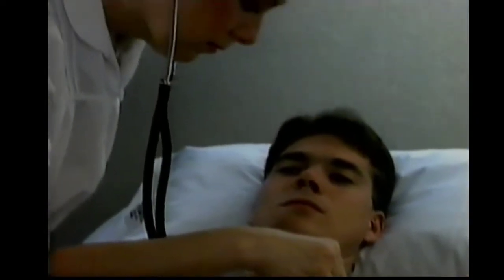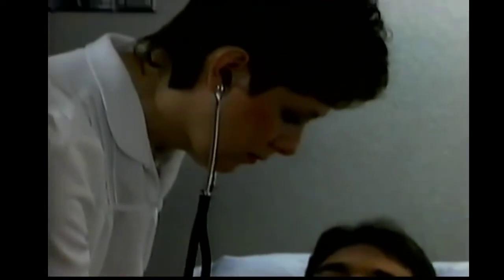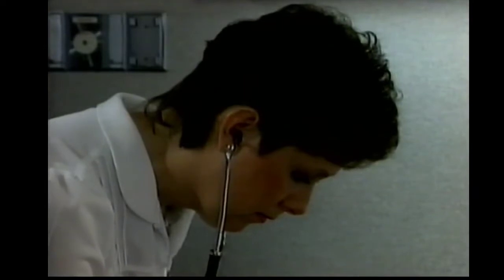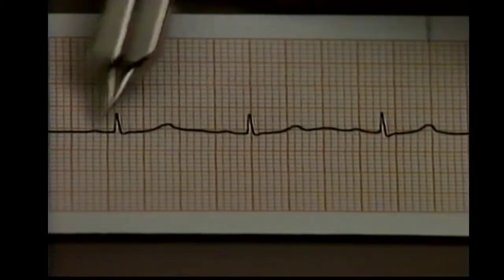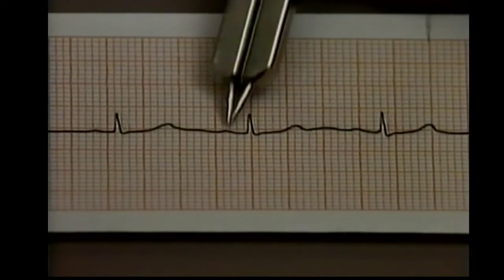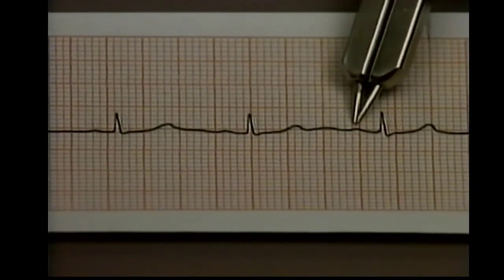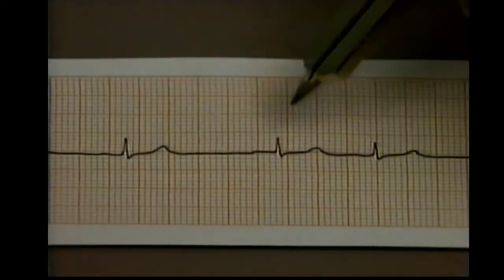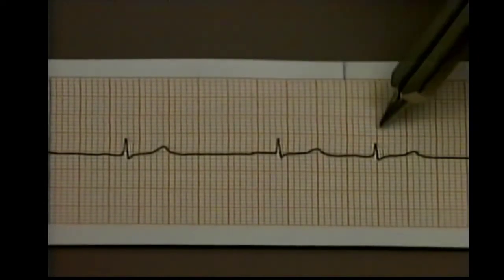But during auscultation, the nurse heard an irregular heart rhythm. She reported this finding to the doctor, who ordered a 12-lead EKG and a rhythm strip. On the strip, the P wave is always present and looks normal. It is positively deflected in lead 2. A QRS complex follows every P wave.